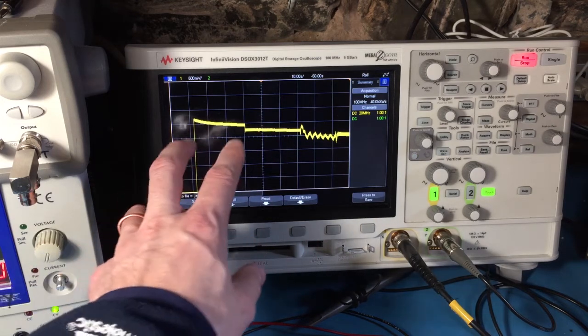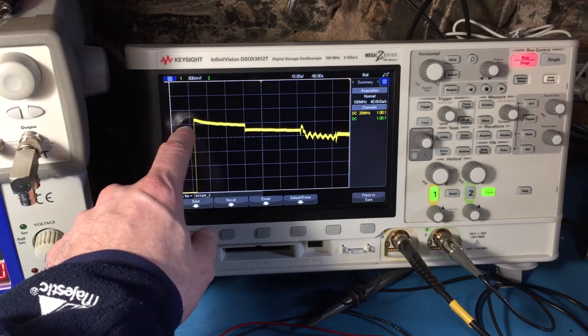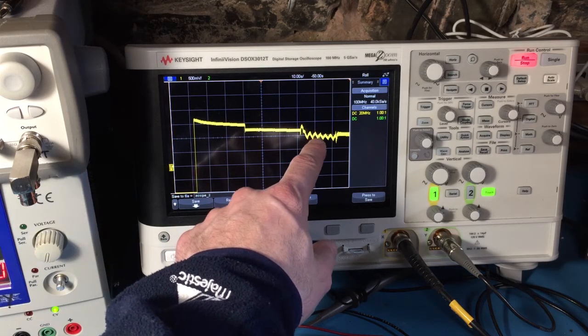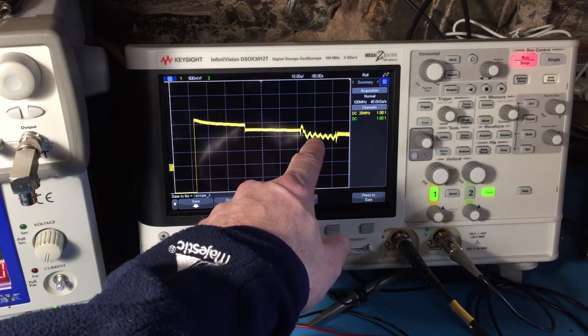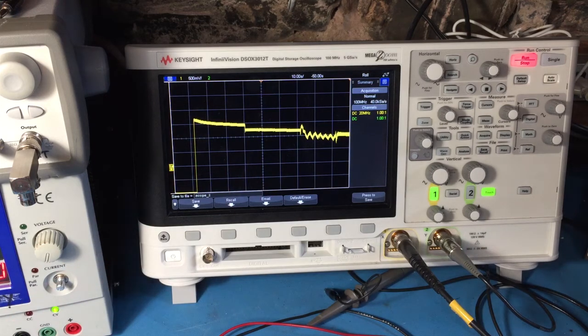But the important thing to realize here is that the drift is really slowly acting in time. Notice it's moving maybe like 100 millivolts over 30 seconds, whereas the period of the breath signal is maybe 4 or 5 seconds or even less. So the fact that those have different time scales allows us to use a filtering technique to filter out the really long time scale waveforms, but allow the higher frequency breath signals to pass through. So that's basically what this lab is about, is how to do that filtering.